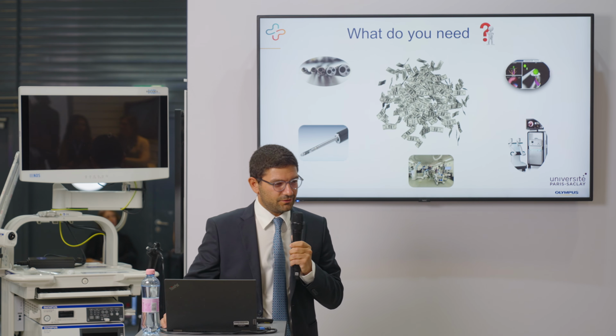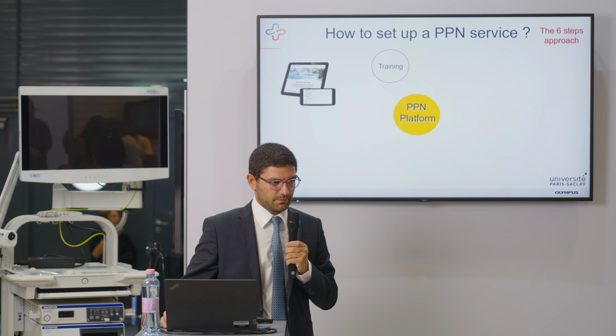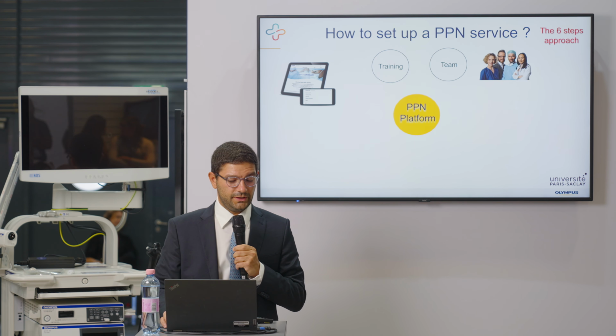Well, actually, yes, you need money, but I developed a 6-step approach to set up a peripheral pulmonary nodule service. Money is one of them. You need training, you need to build a team, you need the equipment and the money, you need to set up your protocols, you need to have the patients, and finally discuss patients in an MDT meeting.